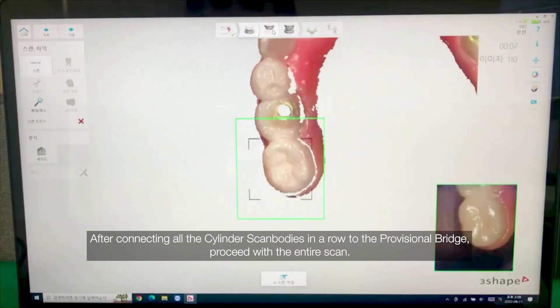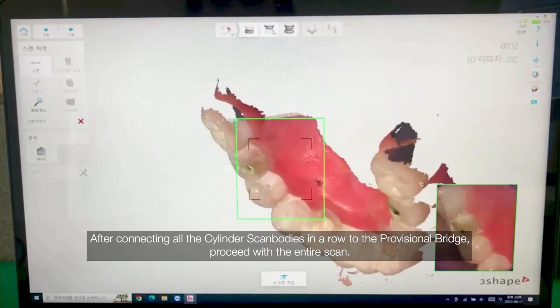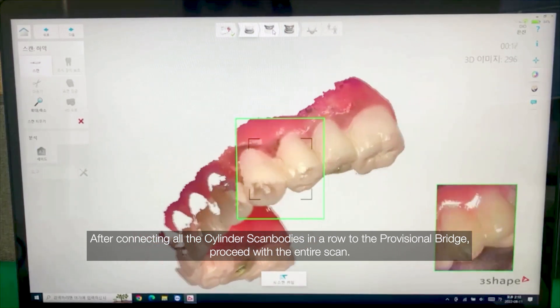After connecting all the cylinder scan bodies in a row to the provisional bridge, proceed with the entire scan.